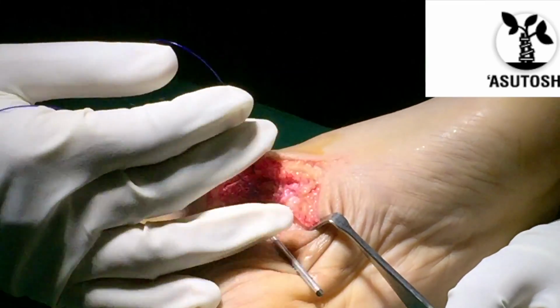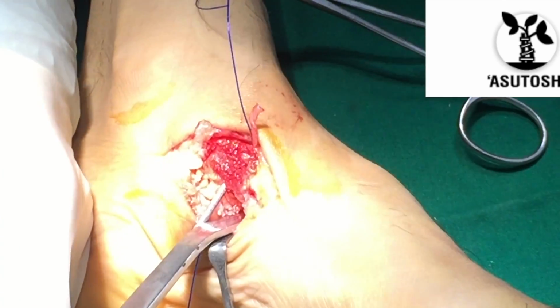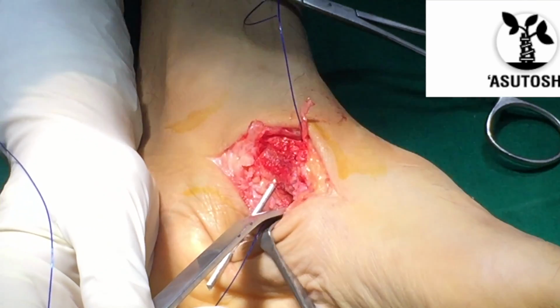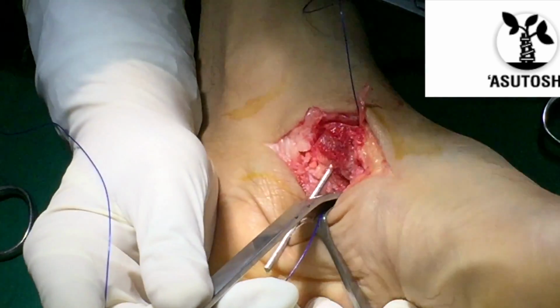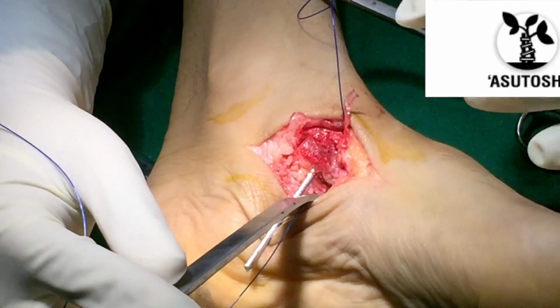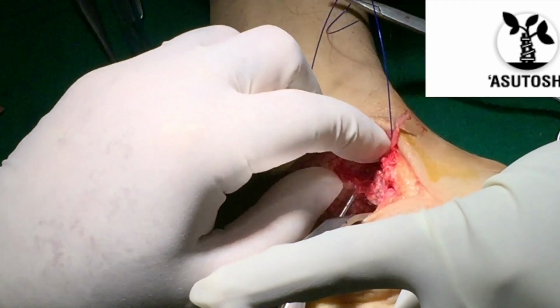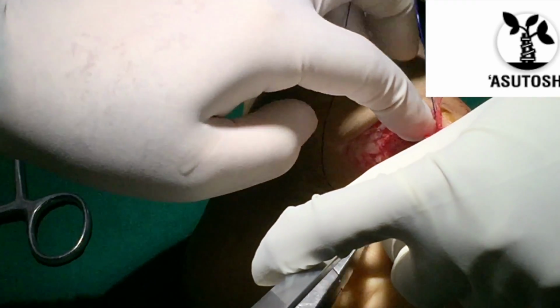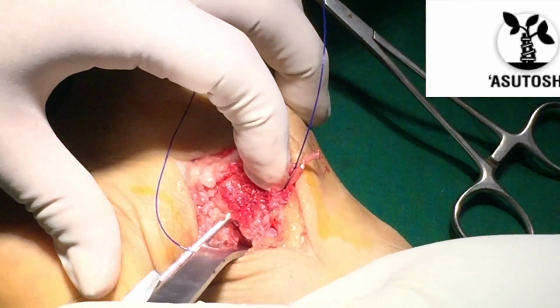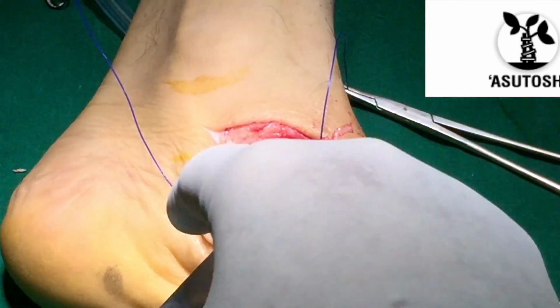Now the K-wire that we see, we have decided to remove the K-wire. So with very gentle movement, we are removing the K-wire.